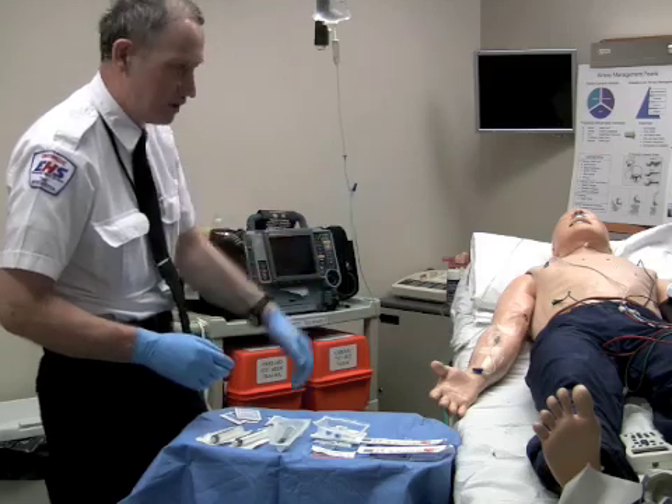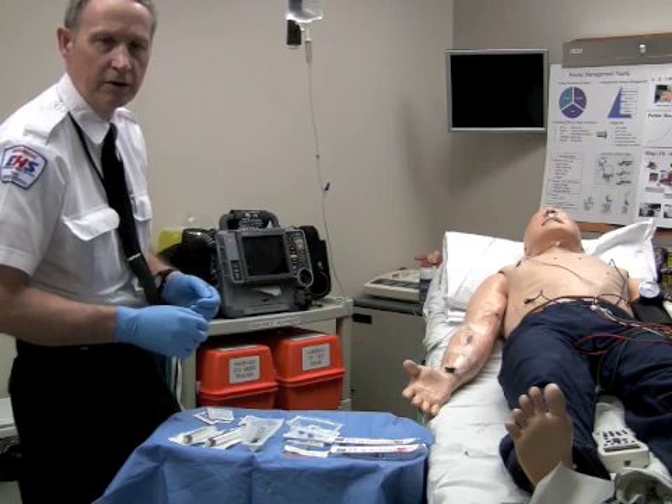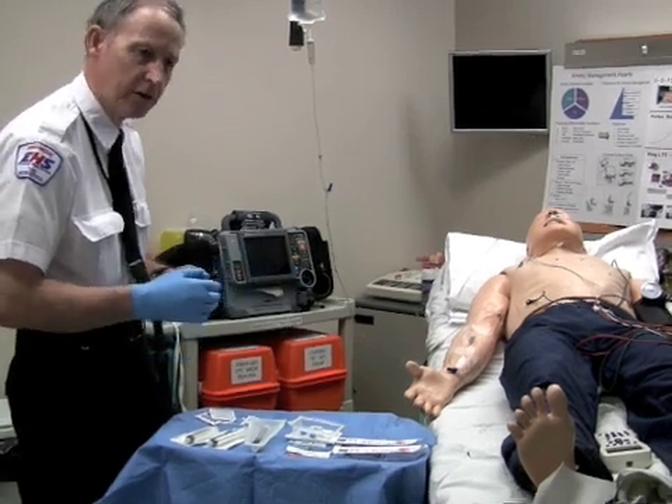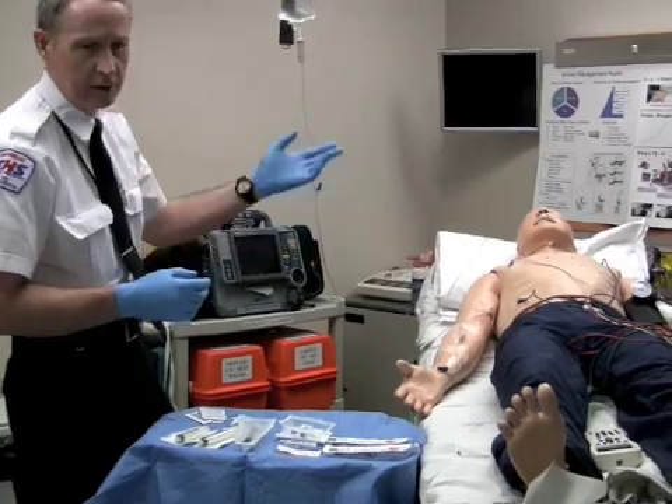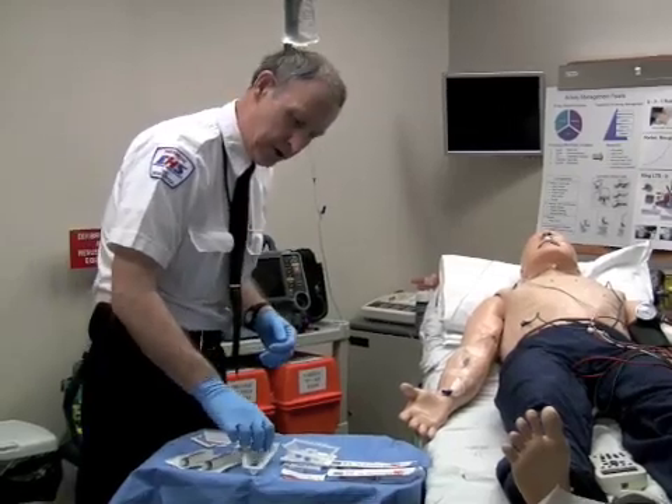We have our subject here presenting with tachycardia of 160 and is indicated for the use of adenosine. Awake, not too hypotensive. And we will begin first by setting the thing up.